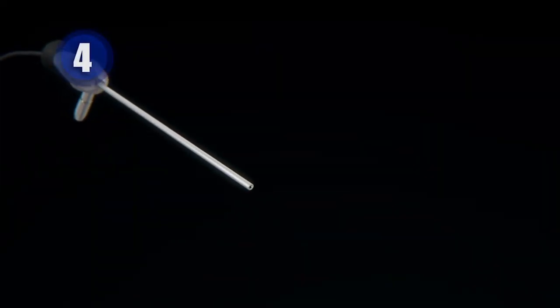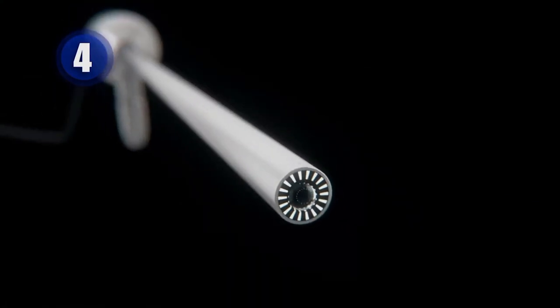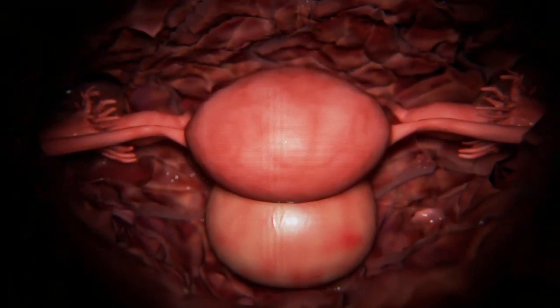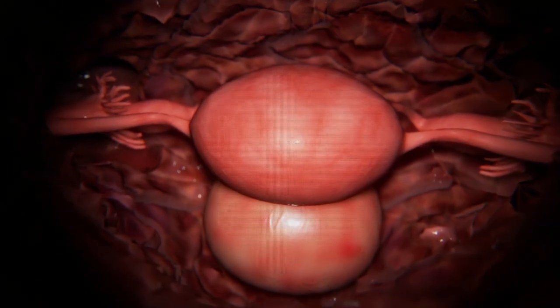In the operating room, images from the laparoscope camera will be displayed on a monitor. Your surgeon will carefully examine the tissues and organs in your pelvis to look for any indications of a disease that could account for your symptoms.